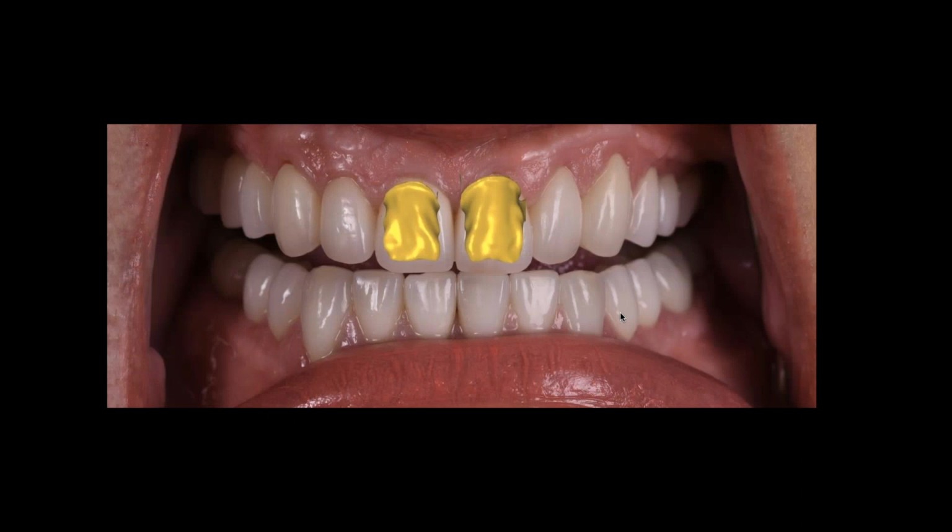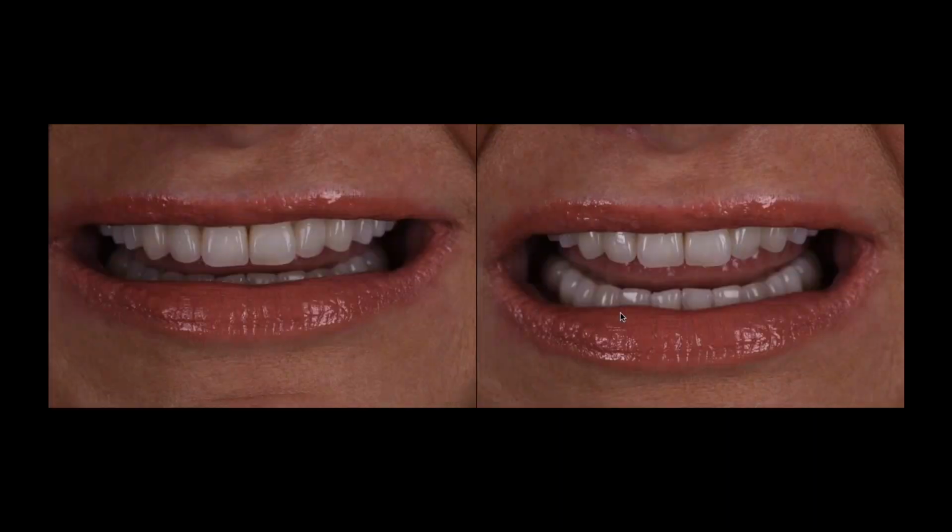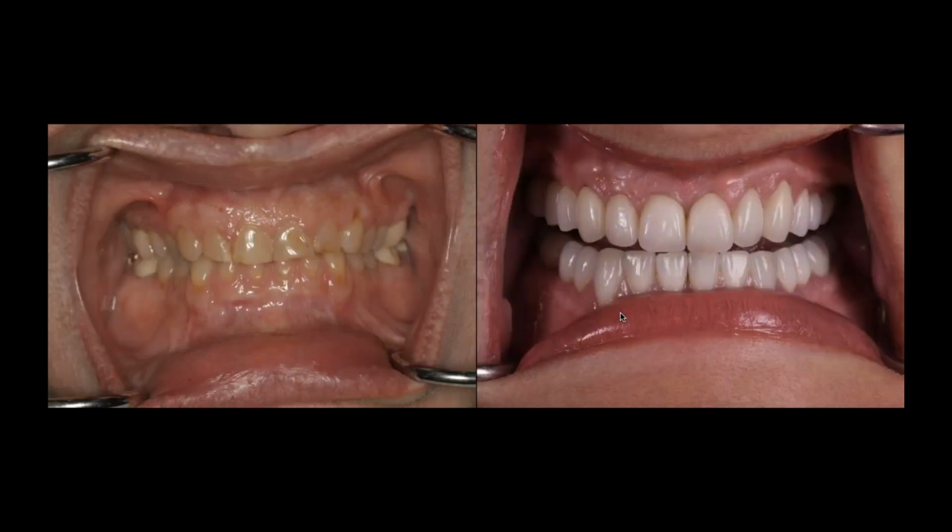These were all zirconia fully layered restorations with a few monolithic in the posterior second molars. The substructure design is very, very critical, and we spend a lot of time talking about that both in general and in courses and so forth, because I think designing that substructure becomes critical. And you can see her final result, again, 28 single unit zirconia restorations, all layered with VM9. And there is a nice before and after for our patient.